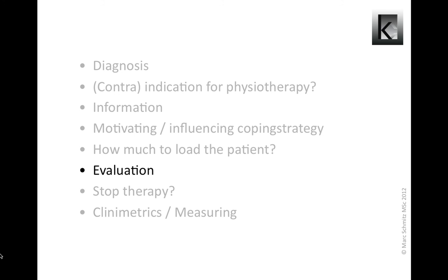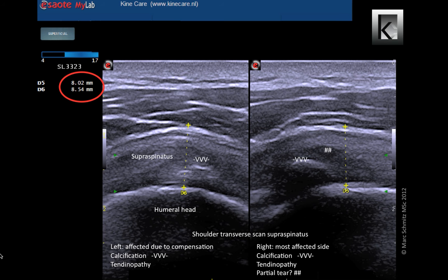Evaluation is something every physiotherapist is required to do periodically. This is a scan I made of a patient at the beginning of treatment. Each month I assessed the connective tissue repair of the partial tear which can be seen on the right side. Each month it improved and the training load could be adjusted to the new situation. After nine months the partial tear was completely healed. The calcification however remained in location and size.